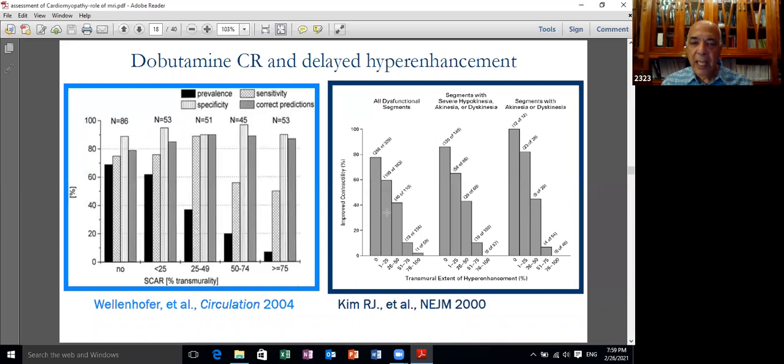And on the y-axis is the capability of reviving myocardium. After revascularization, you get the myocardium contracting again. So in viability studies, if you have 0 late gadolinium enhancement, this means that the possibility of having viable and contracting myocardium after 6 months in this study is very high.